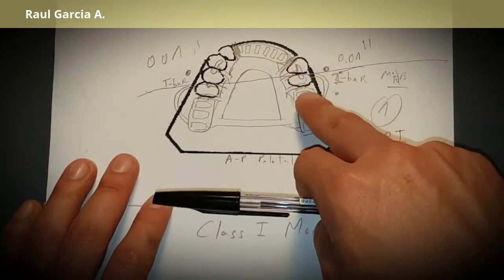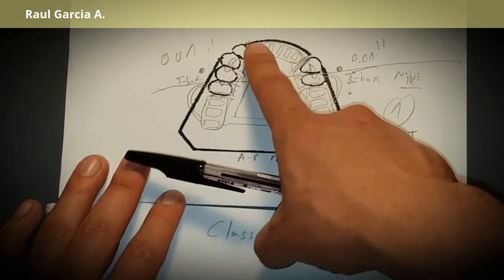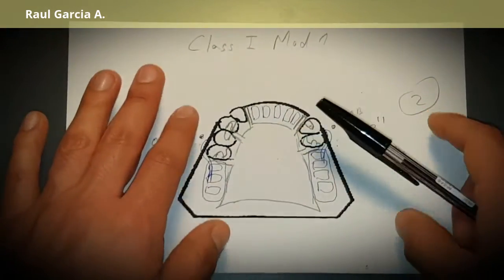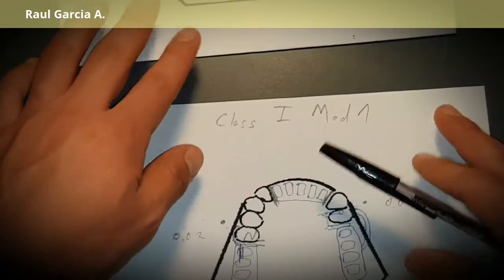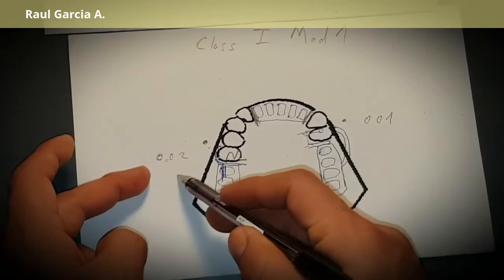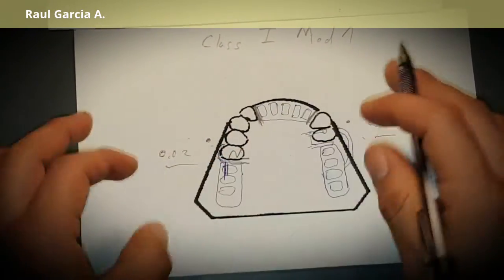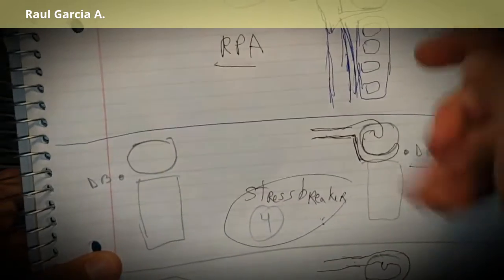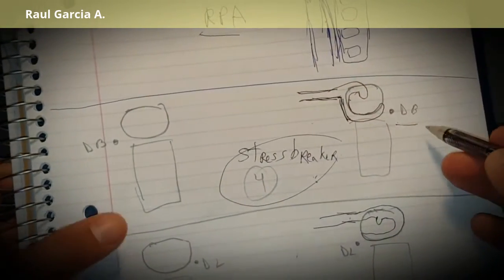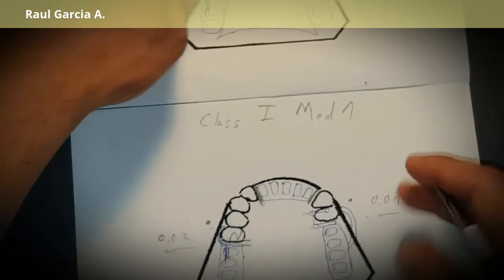Comparing the variations: in the first design using RPI, everything is positioned as shown. In the second using wrought wire, we adjusted slightly due to undercut position. A third possibility: if you have 0.02-inch undercut on one side and 0.01-inch on the other, you put a wrought wire on one side and an RPI on the other — or vice versa. If undercuts are elsewhere, use RPA or a stress breaker for a distal buccal undercut.